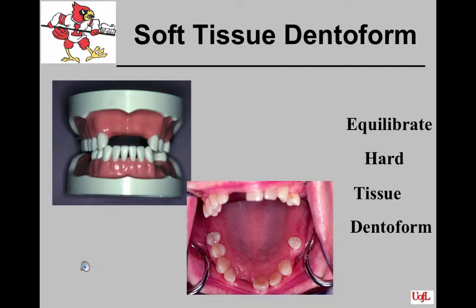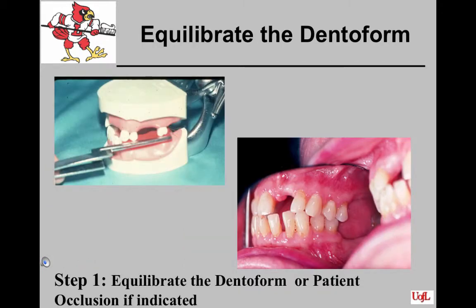This patient has enough of a repeatable bite that we will restore him with his RPD in maximum intercuspal position. You may not know some of this until you actually finish mounting the case. Before you start any permanent crowns or restorations, you would want to make sure that your equilibration of the patient is completed at that time.